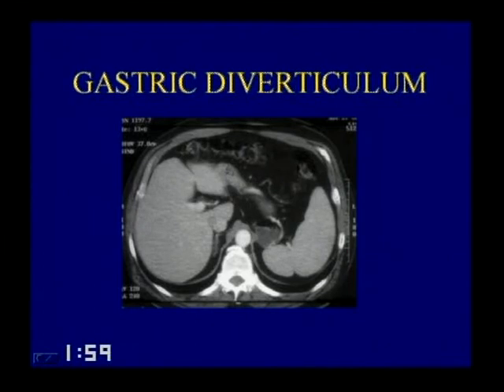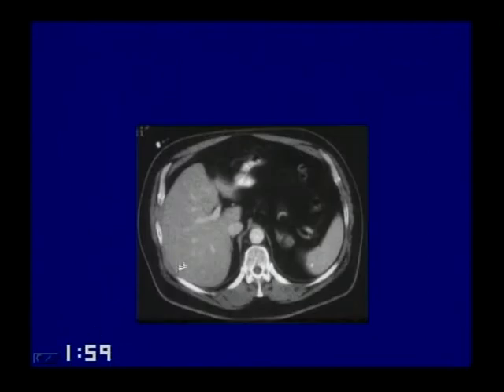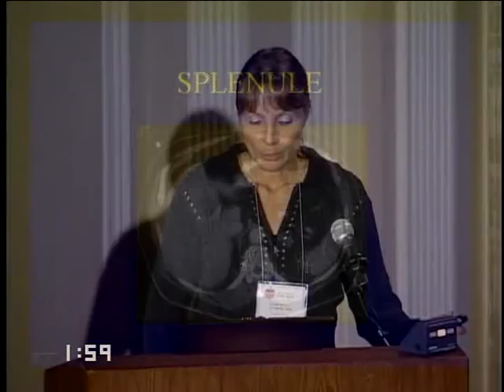Here was another little adrenal nodule picked up in a patient who had a lung carcinoma, and they were very worried about metastasis. So we did a biopsy. Biopsy confirmed needle position, skewered this thing right through the middle, had a nice clean shot coming slightly lower through an intercostal level, got that thing, turned out to be a splenule. It was all splenic tissue. So that concludes the adrenal imaging.